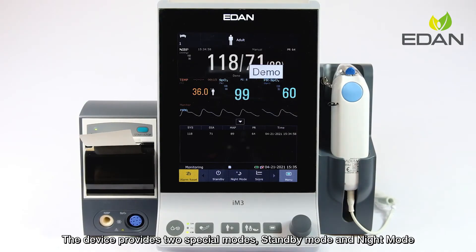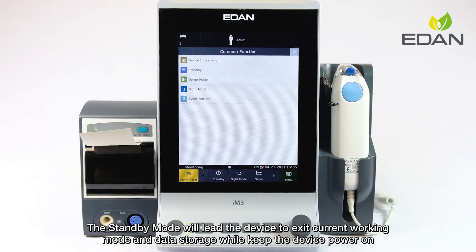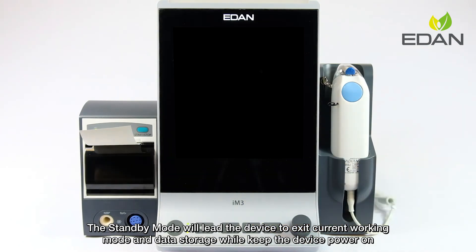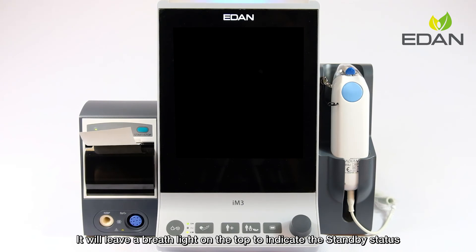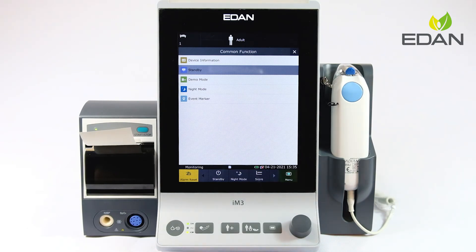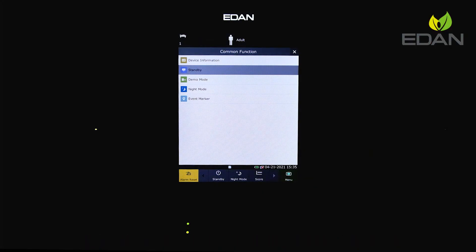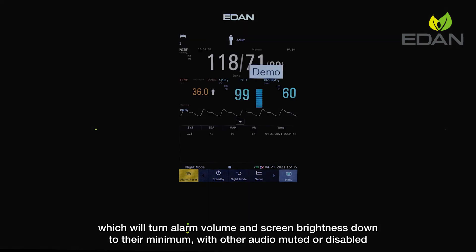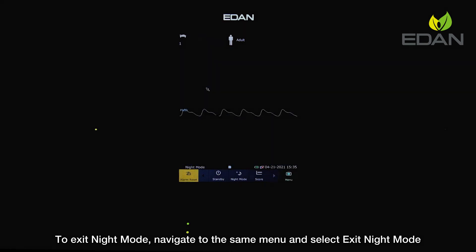The device provides two special modes: standby mode and night mode, found under common functions in the menu. Standby mode causes the device to exit the current working mode and pause data storage while keeping the device powered on, leaving a breath light on top to indicate standby status. Press any button to exit standby mode. Night mode is designed to avoid disturbing patients at night while still monitoring them — it turns alarm volume and screen brightness down to their minimum and mutes or disables other audio. To exit night mode, navigate to the same menu and select exit night mode.